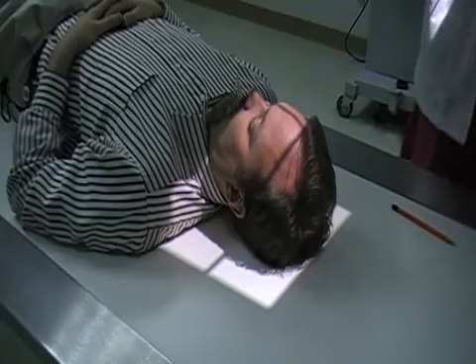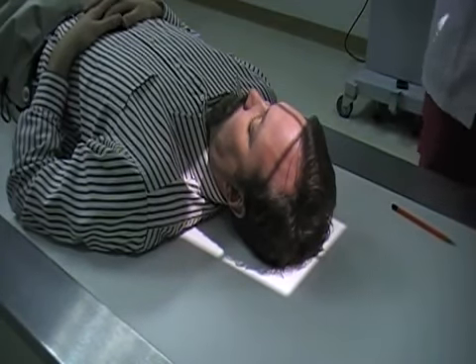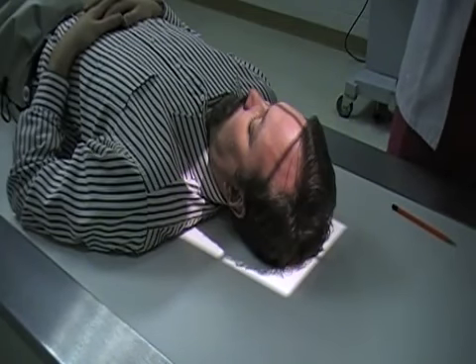Now I'm using a 10 by 12 or 24 by 30 centimeter image receptor for the cranial x-ray. Okay, so that is our Towne method.